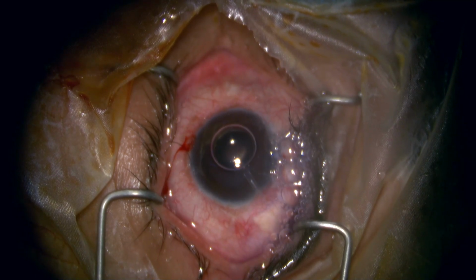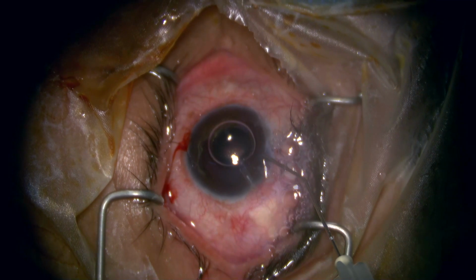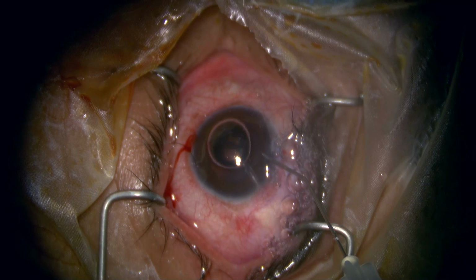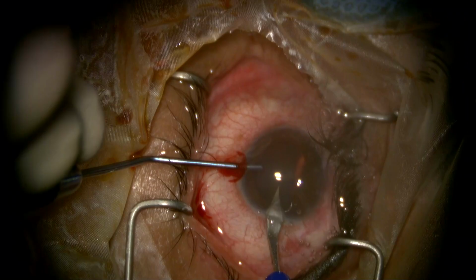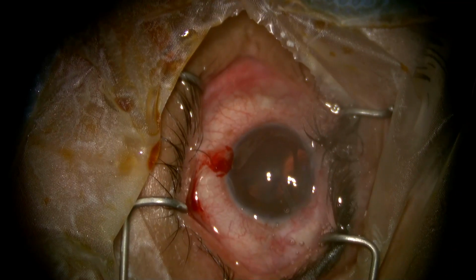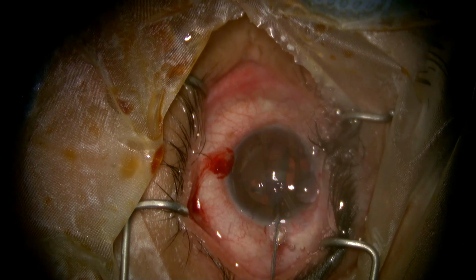After washing the dye, the next step is, preferably, what is recommended is we should use cohesive Healon viscoelastic during capsular access.